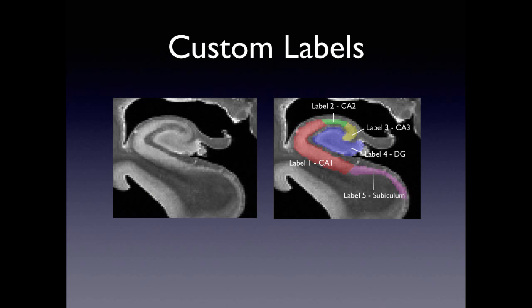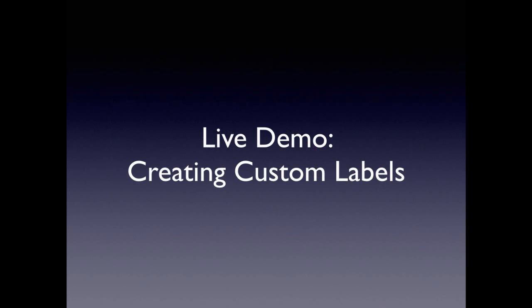The first part with manual segmentation is custom labels. So, you have a complicated structure like the hippocampus where we have at least five labels. We could have many more. Sometimes you have a thousand labels. And if you're going to be doing many segmentations across many subjects, maybe across raters, you have to keep this organized or else statistical inference is impossible. So, the way we do this is by creating custom labels. You can assign a name and an integer value and a color to each label. So you can just save this label file and then load it up when you're doing the next subject, and you have consistency from subject to subject, rater across rater.